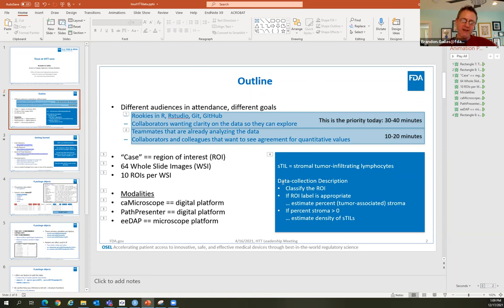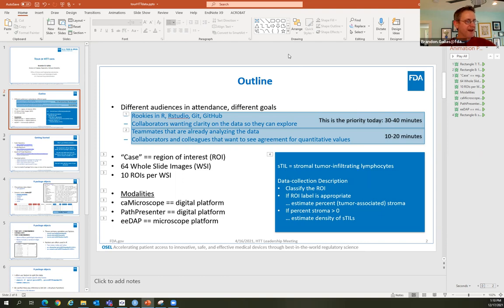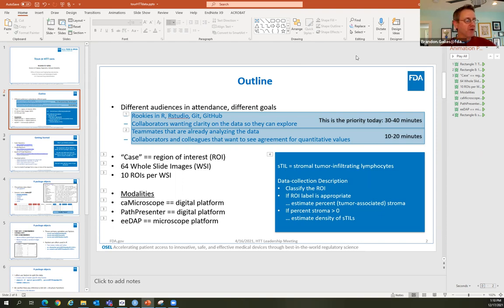The data collection works like this: the pathologist starts with a region of interest shown in front of them. The first question is to classify that ROI — currently four descriptive labels based on what kind of tissue they're looking at: does it have tumor or not, and if it has tumor, is there stroma or not? One category is 'other' — normal or necrotic tissue. Two of the four labels indicate the ROI should be evaluated, and two indicate it should not.